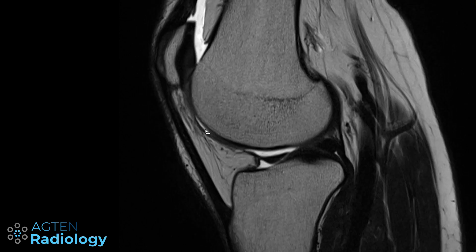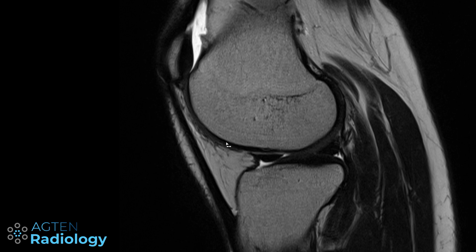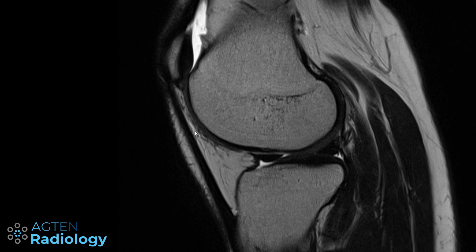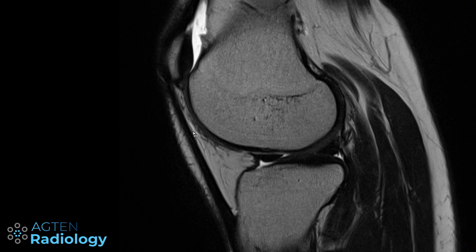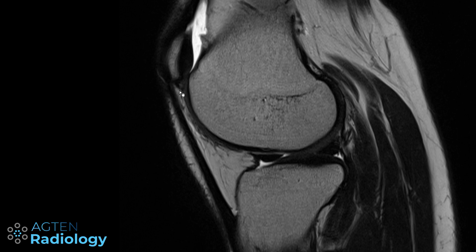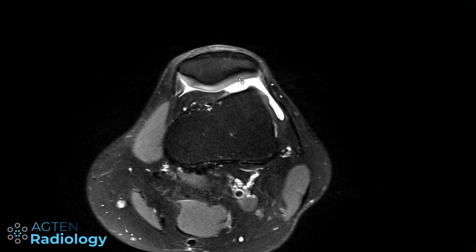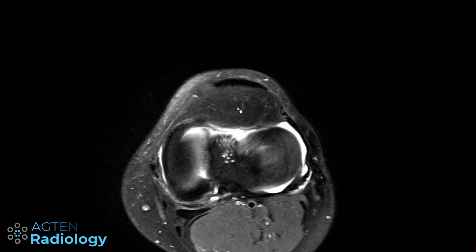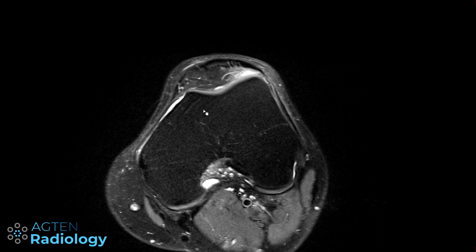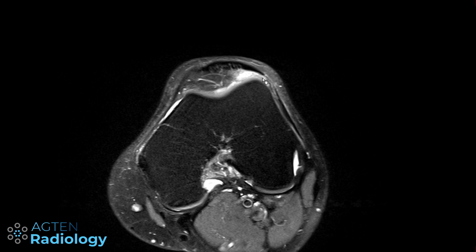If we scroll through the joint going to the lateral side, you can see here in this patient that the distance between the patellar tendon and the lateral femoral condyle is very narrow. You can imagine if this patient is flexing his knee, then what's going to happen is the patellar tendon goes along this way, even further impinging this fatty tissue between the lateral femoral condyle and the patellar tendon. It can be tricky, especially if you don't have experience or have never heard about it — you might mistake it for a little joint effusion or not notice it at all. Frequently you see reports where people do not describe this finding, so especially if patients have anterior knee pain with no trauma, always check this region for this edema.